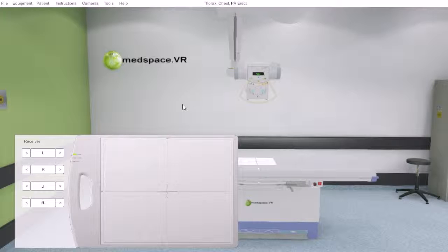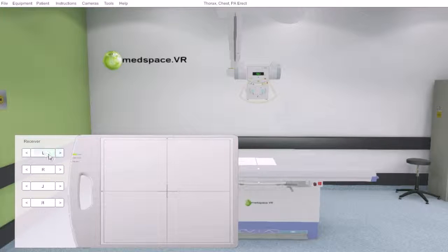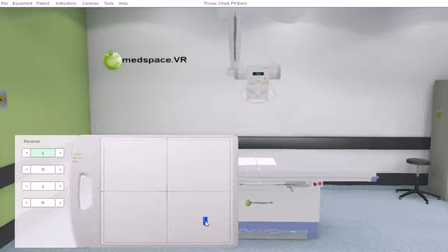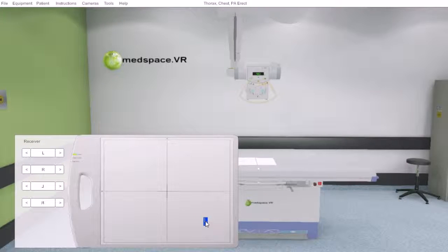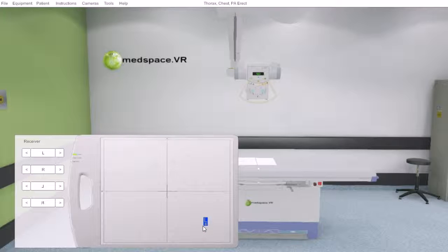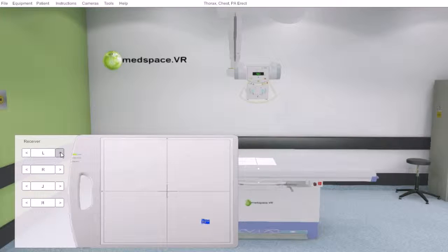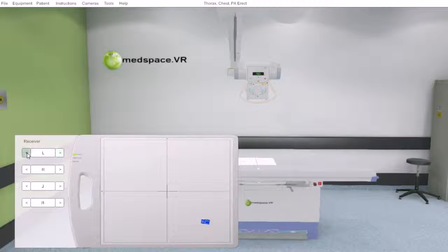We access this purely to place the side marker. We select the marker we want. We drag it to the anticipated location we wish to have on our final image. Once the side marker is placed, we can then manipulate it.